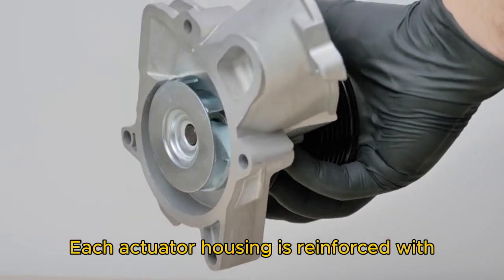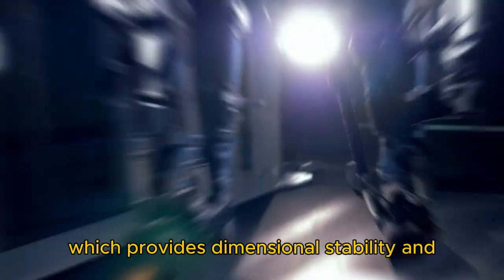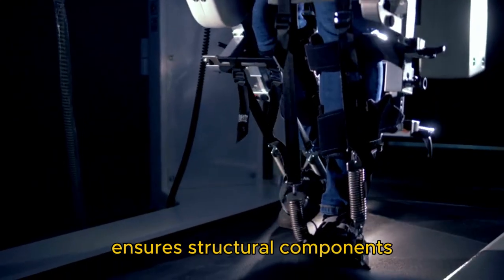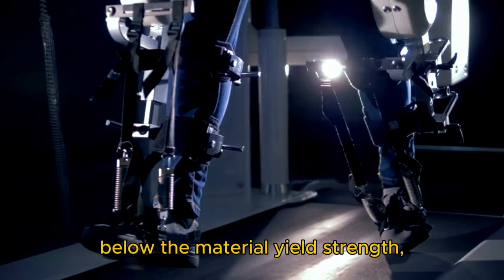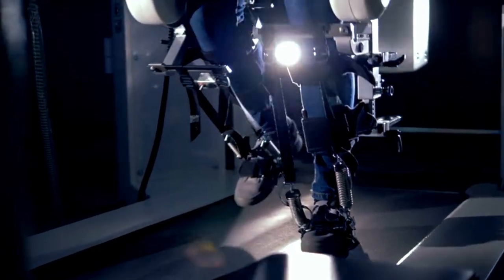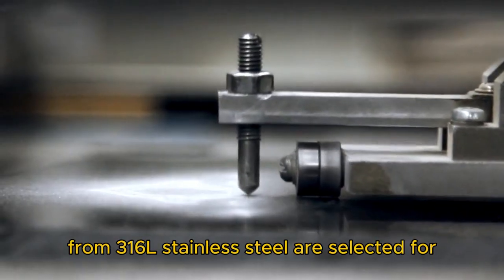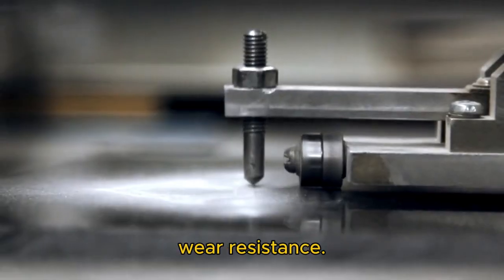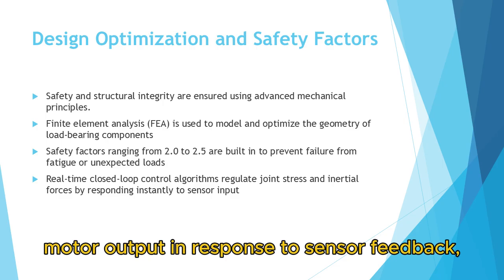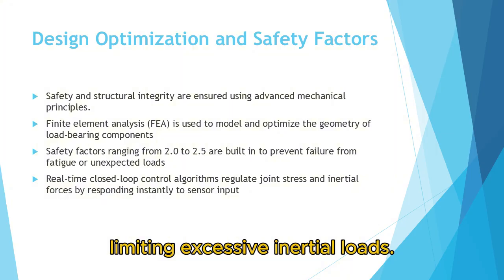Each actuator housing is reinforced with glass fiber-filled polyamide PA66GF30, which provides dimensional stability and vibration damping. Informed geometry ensures structural components maintain stress levels well below the material yield strength, with safety factors incorporated to mitigate failure. Pivot pins and load-bearing fasteners made from 316L stainless steel are selected for their superior fatigue endurance and wear resistance. The system's real-time closed-loop control adjusts motor output in response to sensor feedback, thereby regulating internal joint stresses and limiting excessive inertial loads.